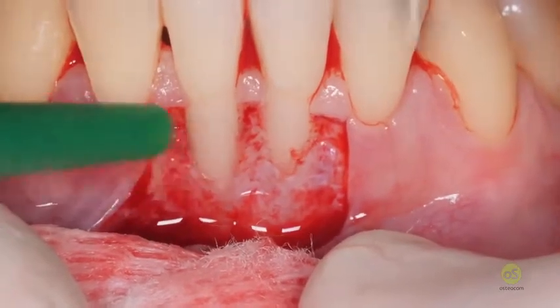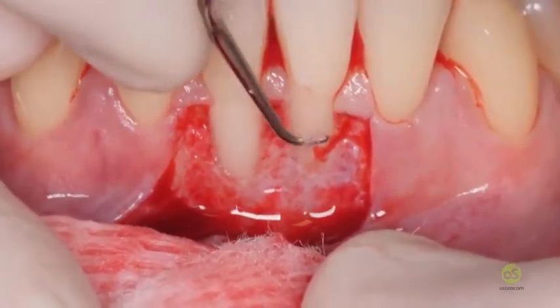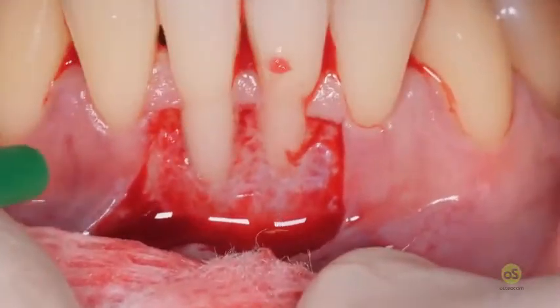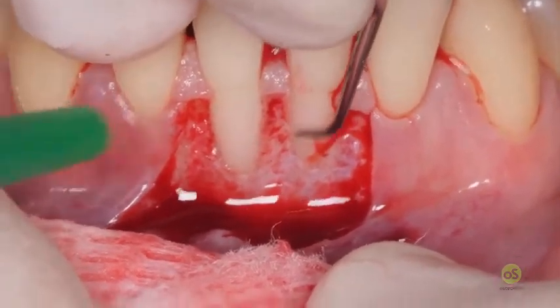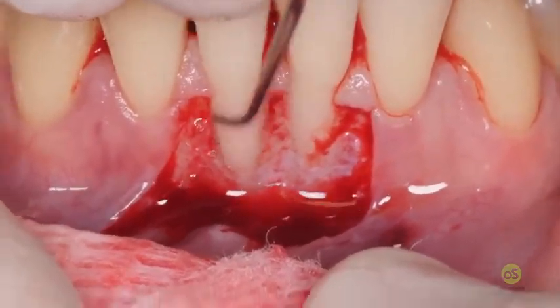Until the root is good. It sounds good. Okay, now I check again.